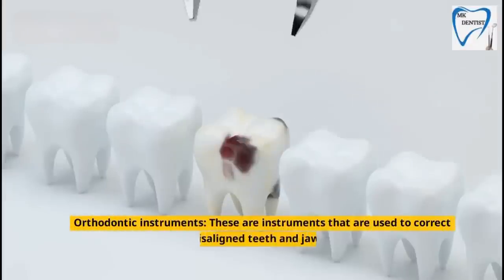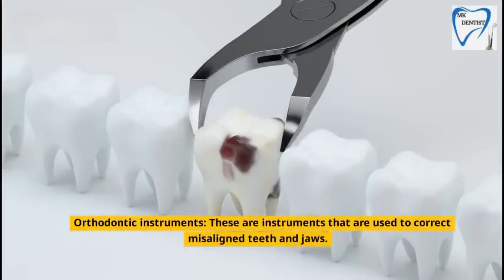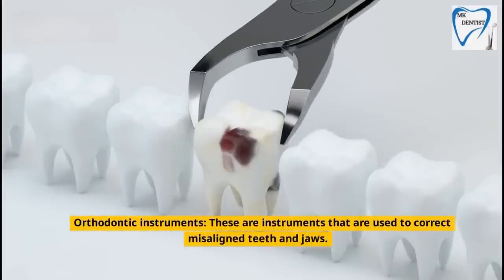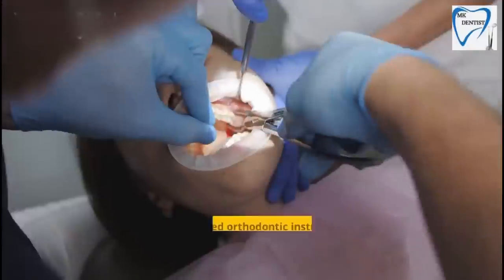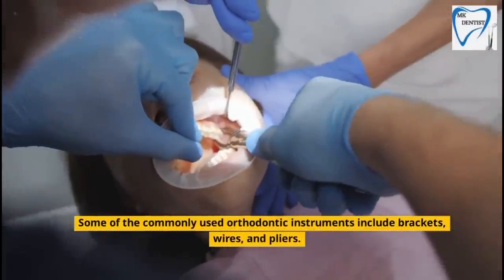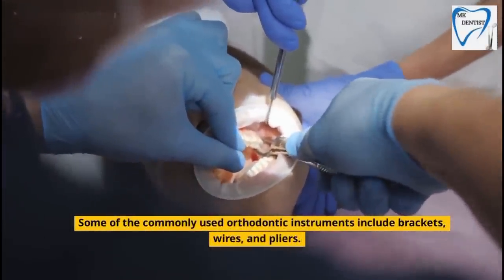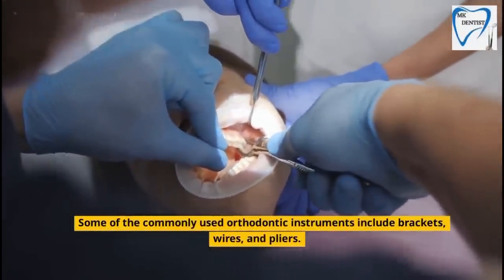Orthodontic instruments are instruments that are used to correct misaligned teeth and jaws. Some of the commonly used orthodontic instruments include brackets, wires, and pliers.